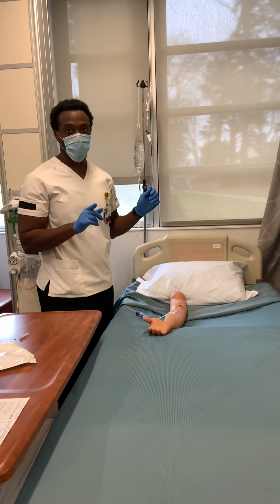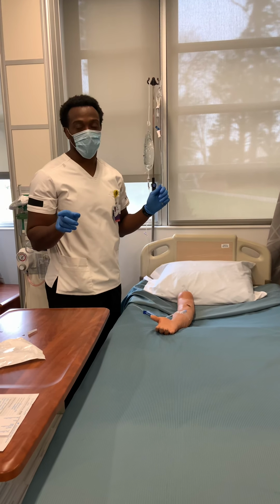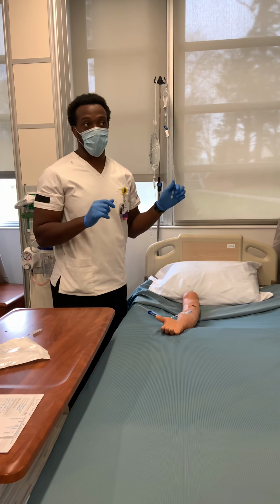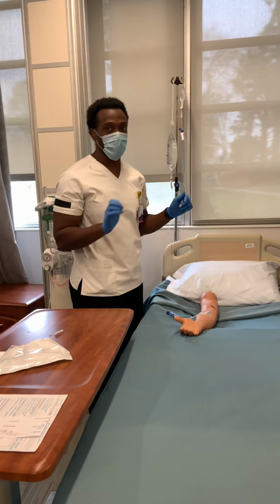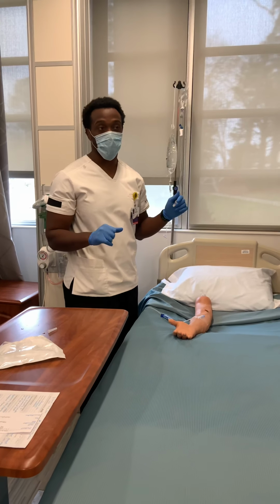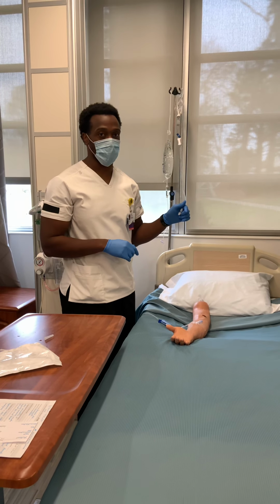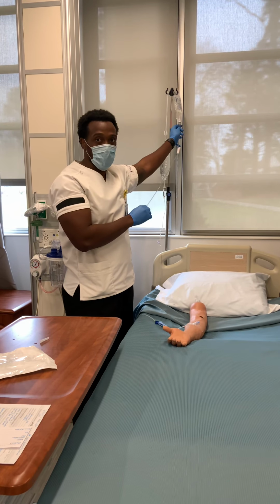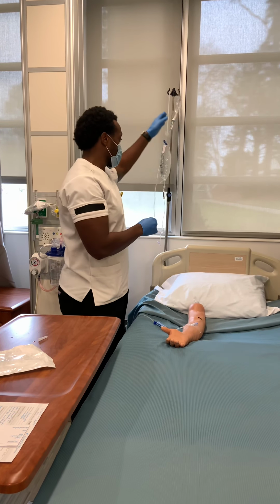I'm given 200 milliliters with the drop factor of 15, over 60 minutes, which is 50 drops per minute. Then you divide that again and get 12 and a half drops per 15 seconds, or 13 drops per 15 seconds. So I would time this so that it drops 13 times within 15 seconds.